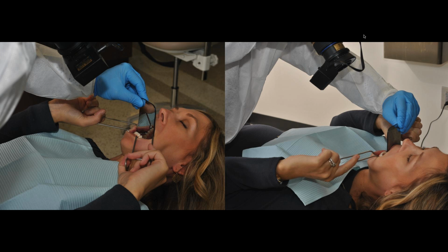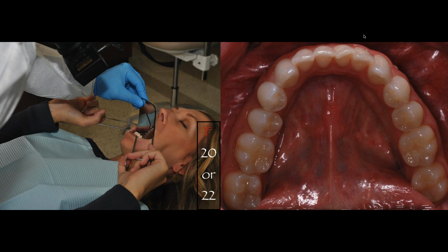Look how close I am from my subject. These photos are all the same. Maxillary and mandibular, I'm actually at the same distance. I'm holding the mirror. Patient is breathing through the nose. Look at the angle. I'm looking at the mirror. I'm actually focusing on the mirror, the reflection of the occlusal surfaces of the mandibular teeth on that mirror. That's the shot I'm taking. And then I take my photo. Same f-stop.